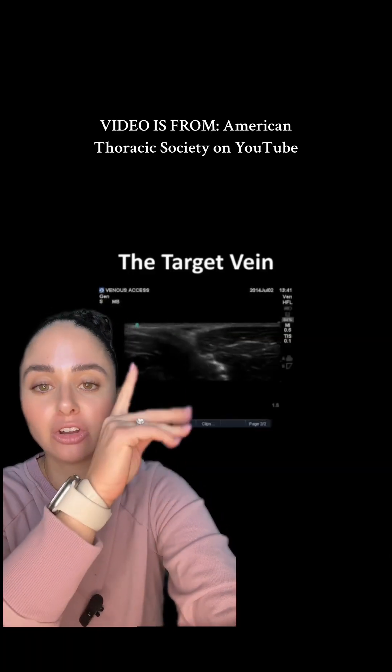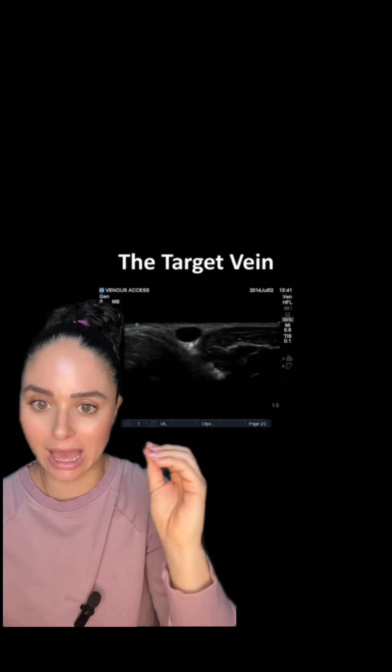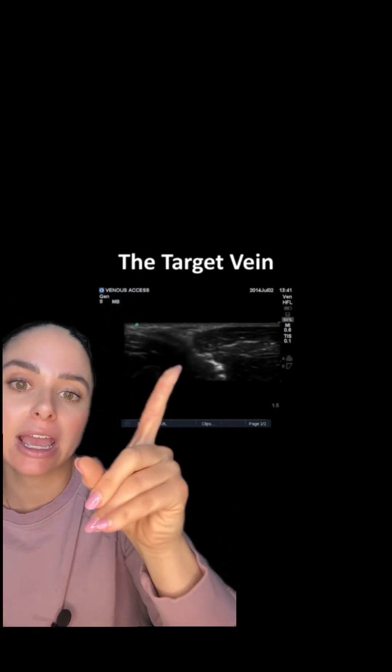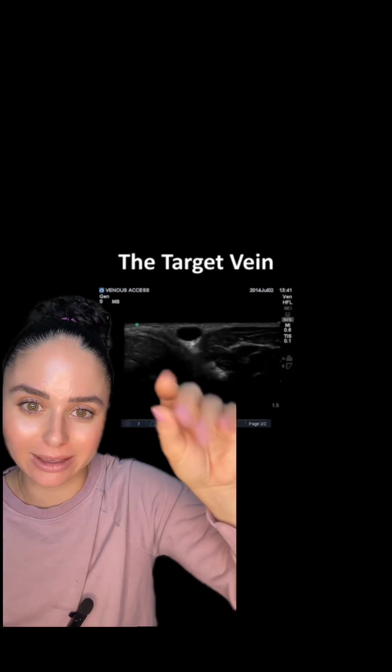I'm going to show you what it looks like to identify a vein as well as what it looks like when you're advancing the needle. First we need to find our target vein. You're going to do this by applying a tourniquet, getting some ultrasound gel, and using the ultrasound to find a vein. You'll be able to tell it's a vein because when you press down on it you'll see this big black hole or circle — the vein should collapse.